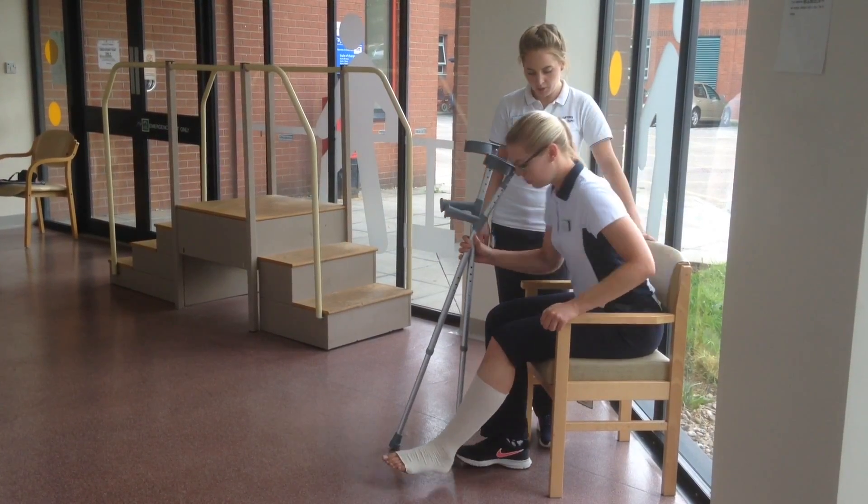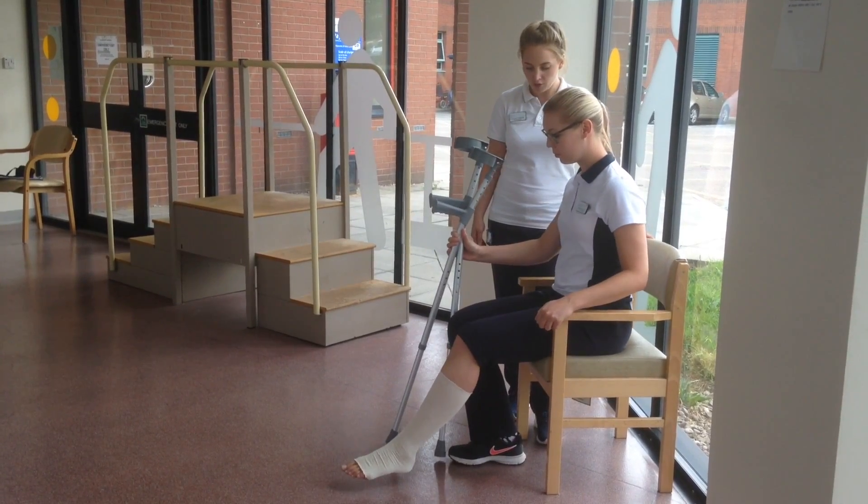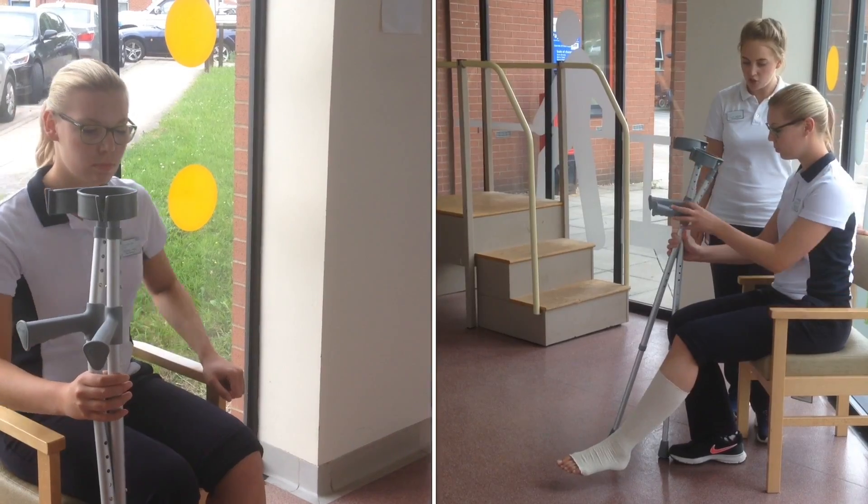Shuffle forward towards the edge of your chair, putting the bad leg in front of you, the good leg underneath you. Make an H shape with your crutches.